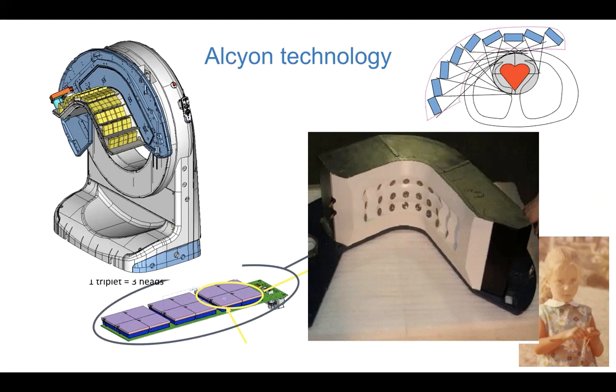To fit the multiple views, the image is reduced in size by means of pinhole collimation, matching the miniaturization to the improved intrinsic pixel resolution of the detectors. This allows the detector surface to be maximized and system efficiency to be increased. So a real multi-pinhole system focused on the heart.